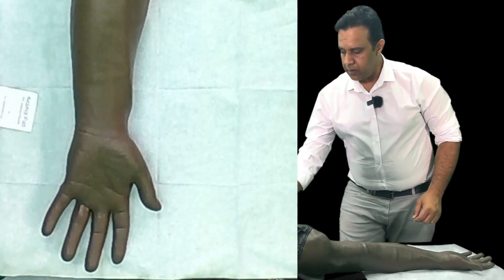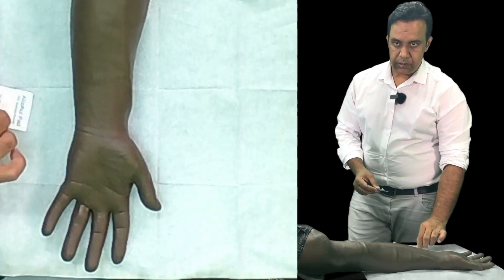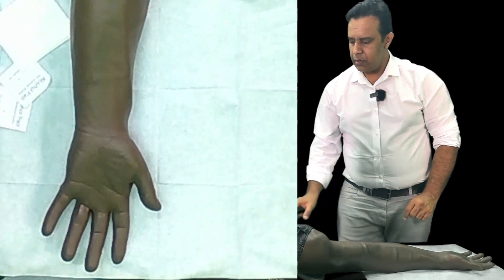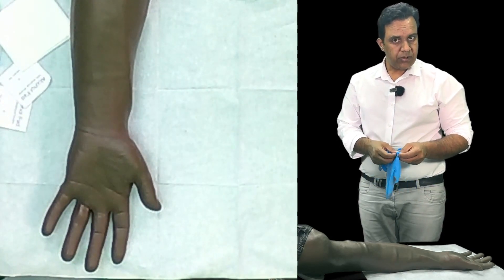After collecting all your materials and explaining the procedure to the patient, you perform the procedure. I will now show you on the mannequin how to perform it — it is very simple and easy. The most important part of this skill is being able to feel the pulse using two fingers. I have the alcohol wipe, syringe, gauze, cap, and gloves ready.